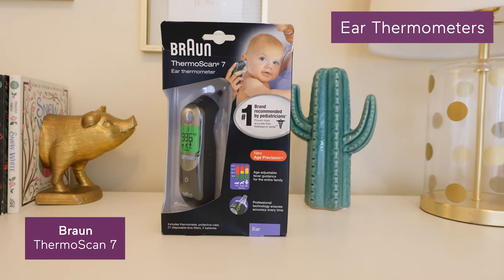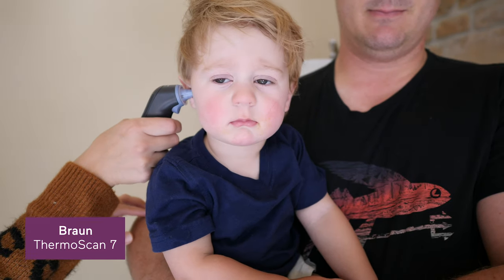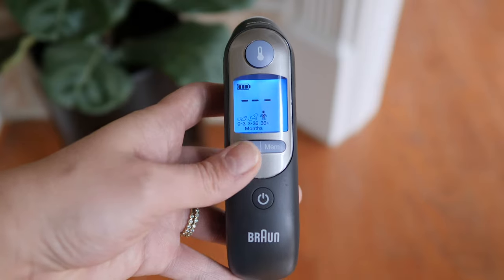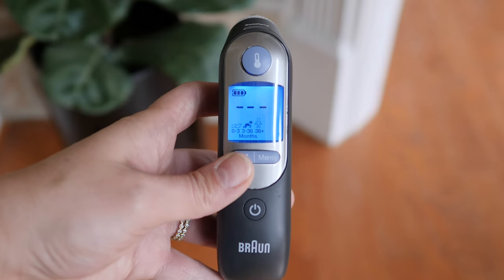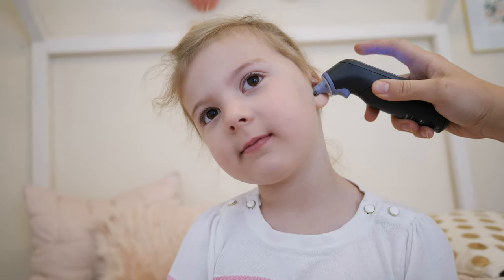If an ear thermometer sounded most appealing to you, then you might like the Braun Thermoscan 7. It can be inserted into the baby's ear and won't immediately shock them because the tip is pre-warmed. You can also adjust the settings to match your baby's age, which is helpful since fever range varies. And it includes disposable tip filters, so you can maintain hygiene while using it between different family members.